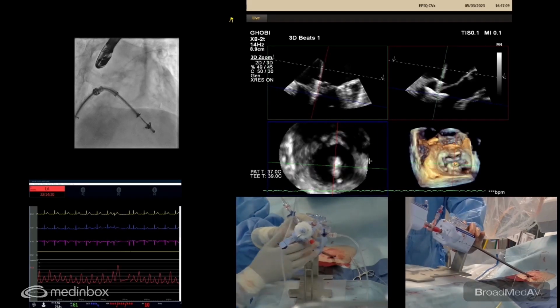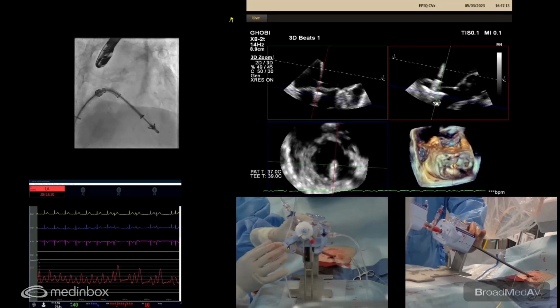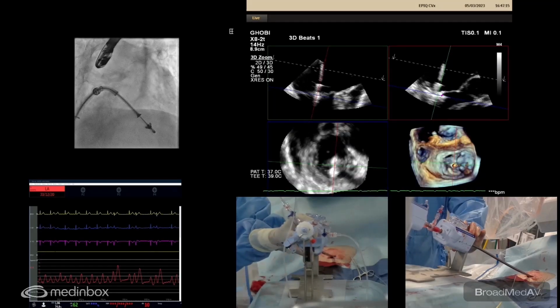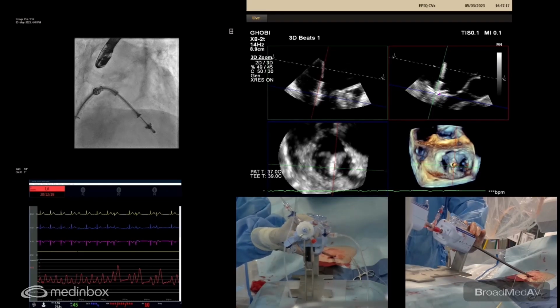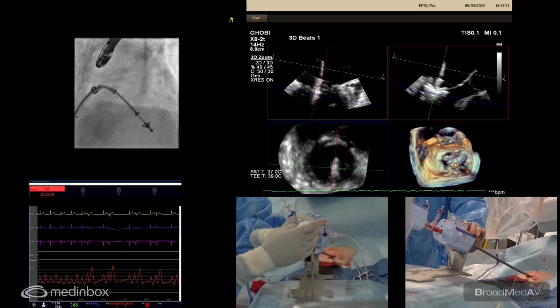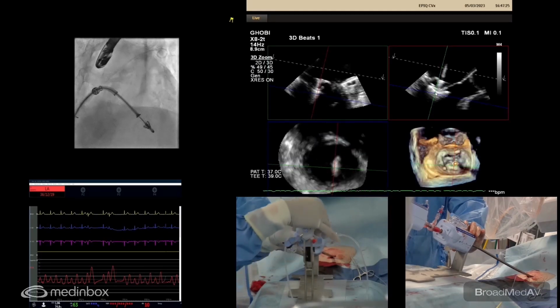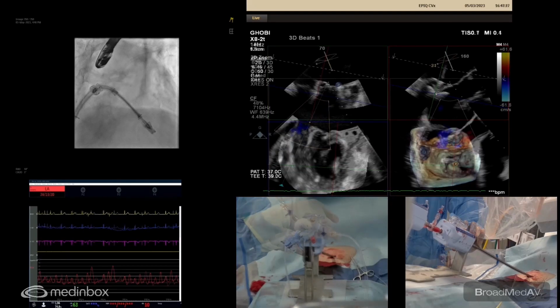I'm just going to pull it up. Tension. Then I'm going to drop the grippers one by one. And I've got both. You can see them quite nicely in there, huh? Okay, so you like it? Both grippers are going nicely. You got all of it. Very good. Let's lock it early. So I'm going to lock the clip.